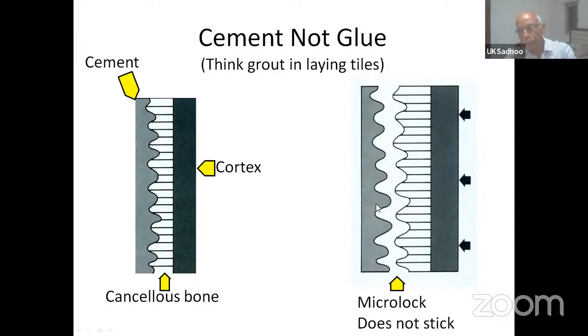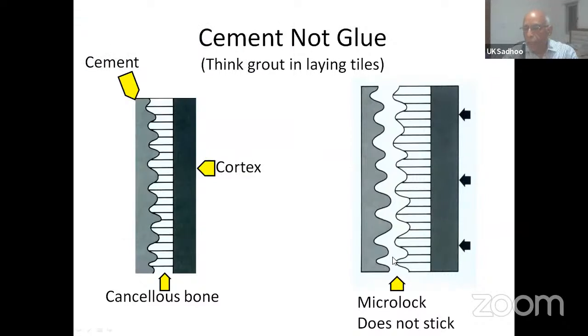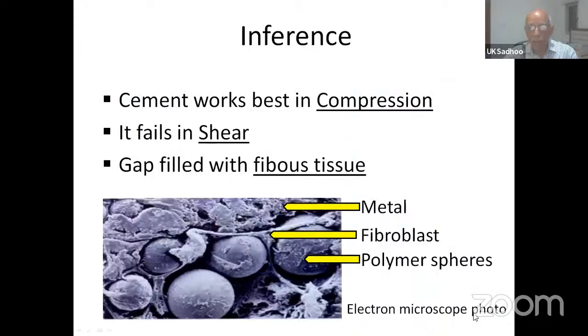But that does not mean the cement actually sticks to the surface of the cancellous bone. It is because of the honeycomb, it just invaginates and makes these micro locks. But if somehow we were to separate these two surfaces, the cement on one side, the cancellous bone with the cortical bone on the other side, it will separate. So the cement wouldn't stick to the cancellous bone. This is the great strength of this concept.